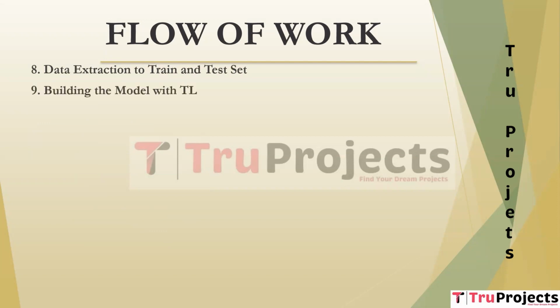Building the model with transfer learning. In this step, the module constructs models using transfer learning techniques, including ResNet 50. It is a pre-trained deep convolutional neural network architecture with 50 layers. In this project, it is fine-tuned using transfer learning to adapt to the task of thyroid nodule classification. It is employed because it is known for its depth and ability to capture complex image features. Fine-tuning it on the thyroid nodule dataset enhances its suitability for the dataset.